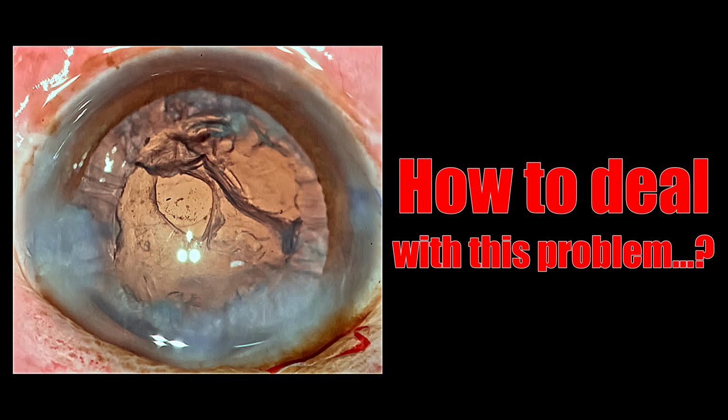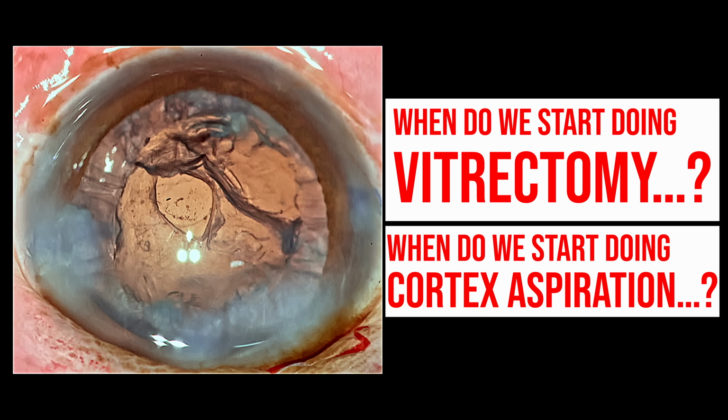Now, how are we going to address each of these issues? When do we start doing vitrectomy? When do we start doing cortex aspiration? And these are some of the points which I'm going to discuss through this video.